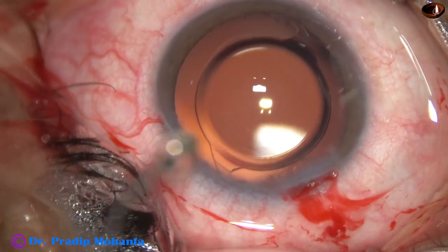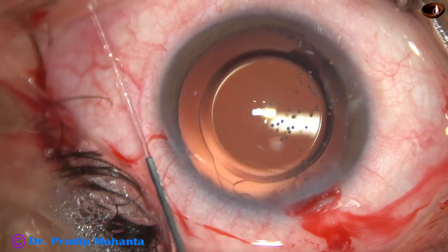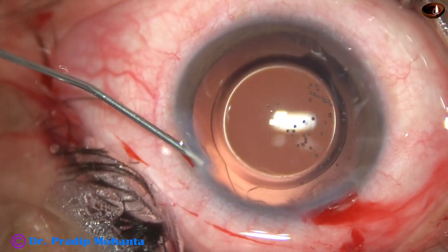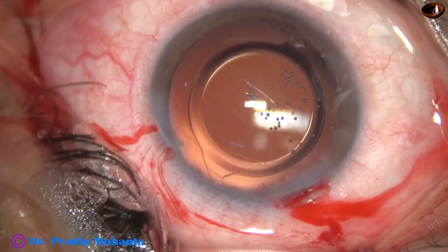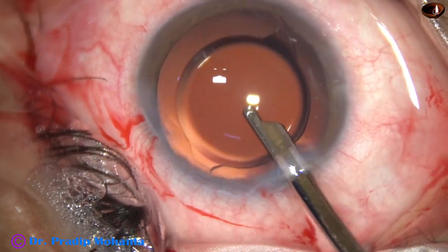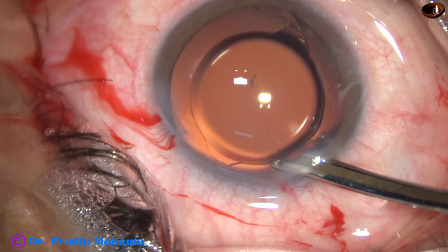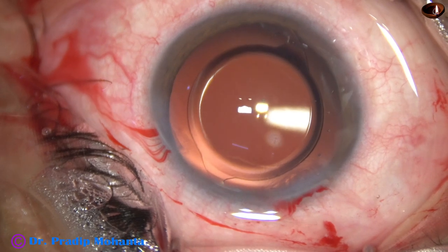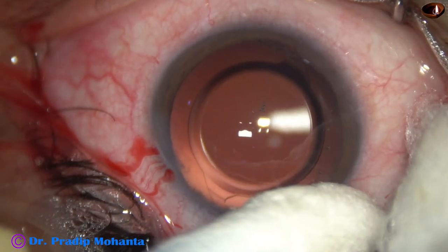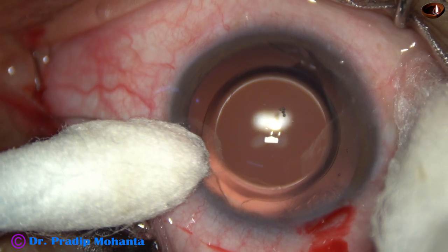After thorough washout of the HPMC, the side port is closed by hydrating the corneal stroma on either side. Then a final lavage of the anterior chamber is done. About 2 milliliters of BSS is directed towards the corneal endothelium to remove any viscoelastic sticking to it. The anterior chamber is formed very nicely, and integrity of all the wounds is checked. A few drops of moxifloxacin are applied over the ocular surface, and the procedure is concluded.